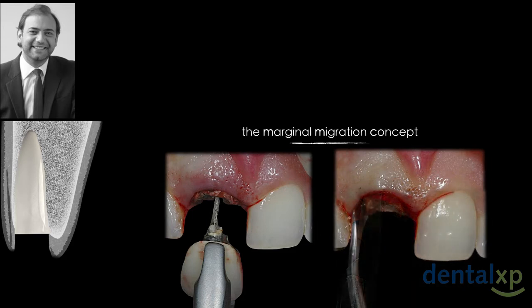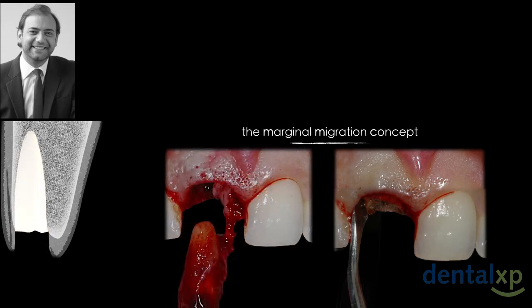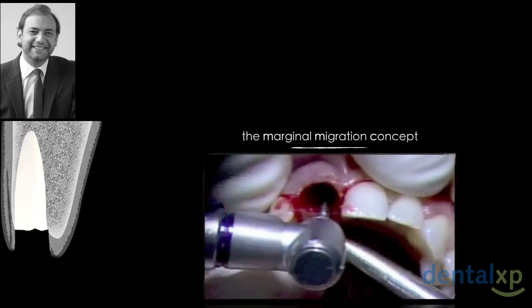It's not a real split thickness flap as we heard from Uli Grunder yesterday, but we mobilize the tissues a little bit. After doing that, we will utilize fine instruments in order to mobilize the two pieces of the root, and we see the defect we have on the mesial aspect. So after doing that, this is a small video, we will proceed with our implant placement.